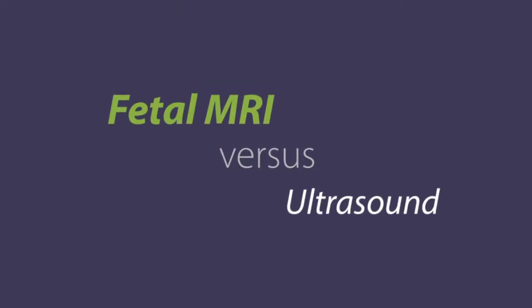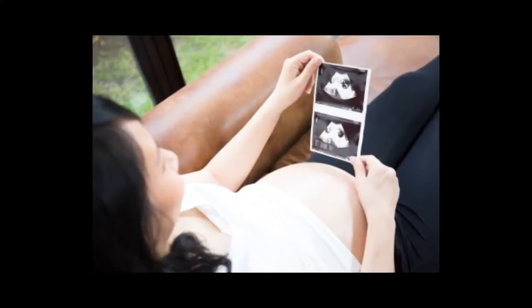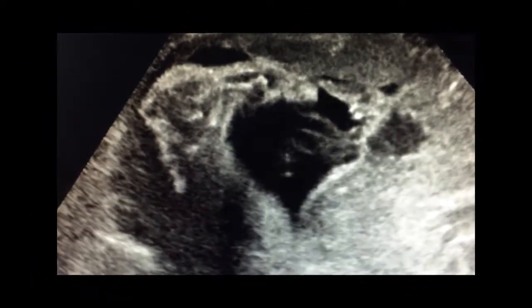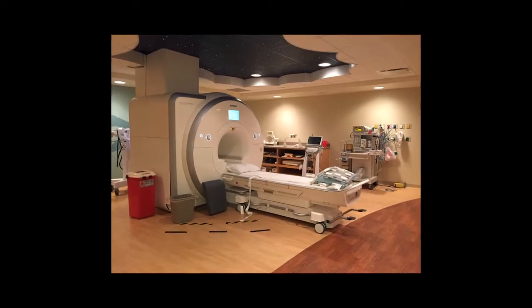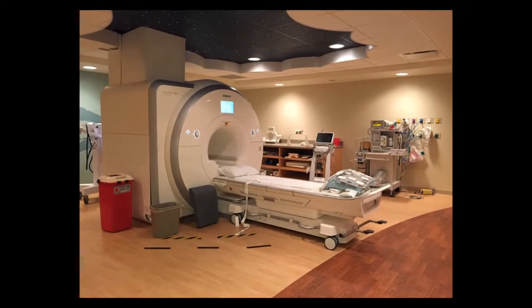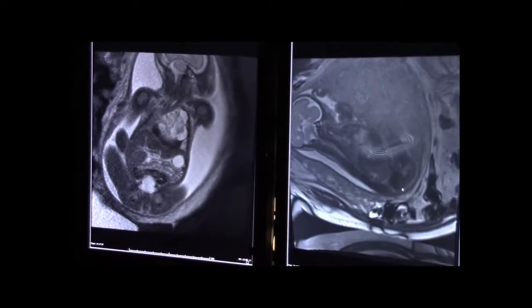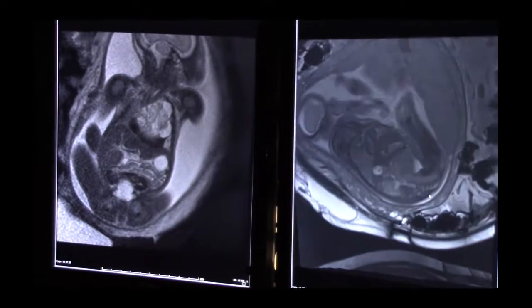You have likely already had an ultrasound of your baby. Ultrasound is an imaging study commonly used to evaluate pregnancy. However, in certain cases, ultrasound evaluation can be limited, and a more detailed exam is necessary to see structures more clearly. Fetal MRI is often the next step if there is a finding on ultrasound that requires further evaluation. MRI is often better than ultrasound at identifying details, and it is also able to see the entire uterus and baby all at once.